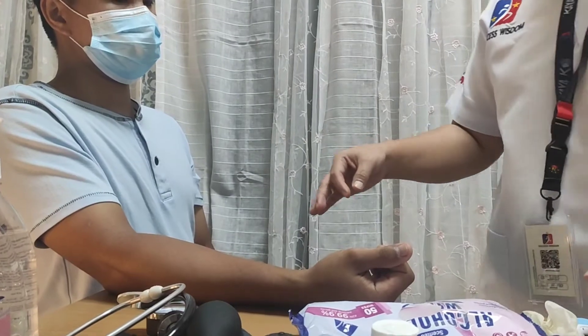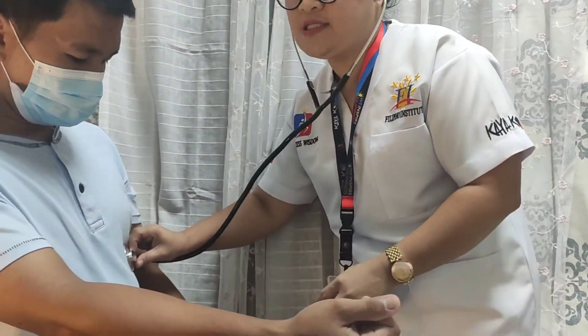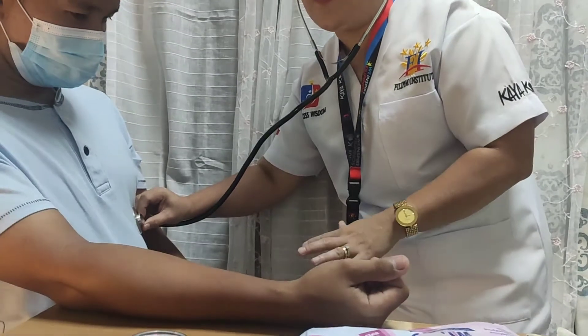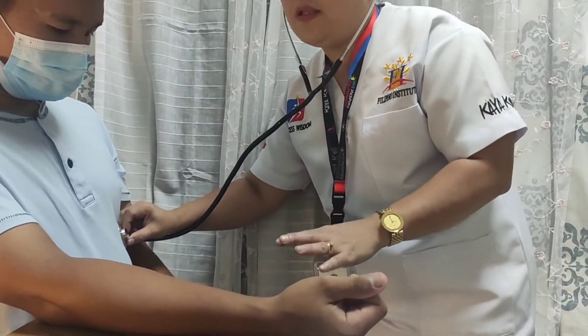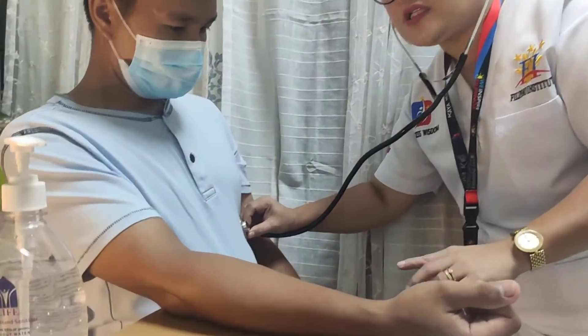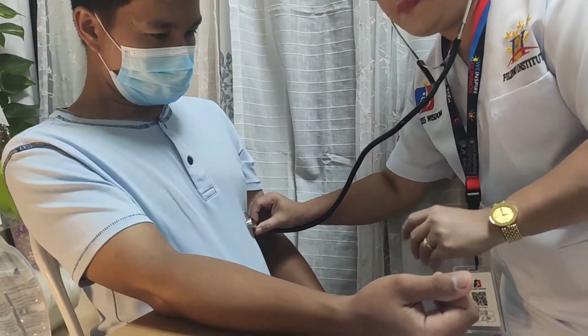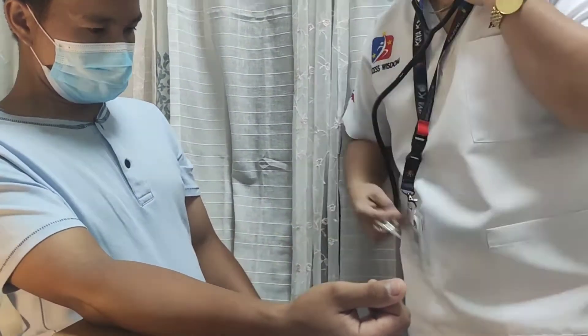To check the heart rate: using the stethoscope, warm the diaphragm. Place it over 2 to 3 inches to the left of the breast bone, below the left nipple. Count the heart rate for one full minute. Note the rhythm, whether regular or irregular, and document the result.